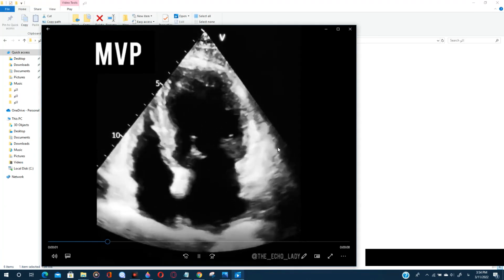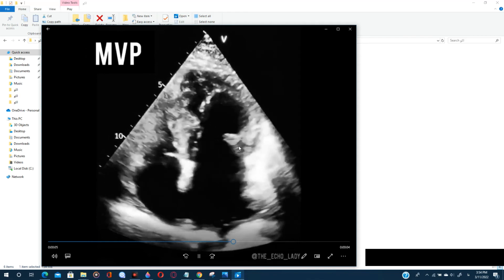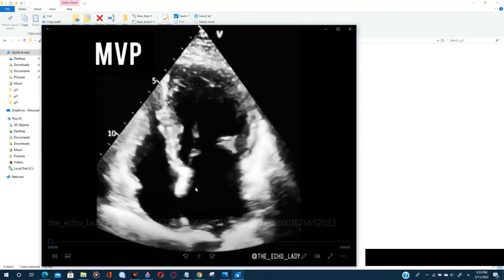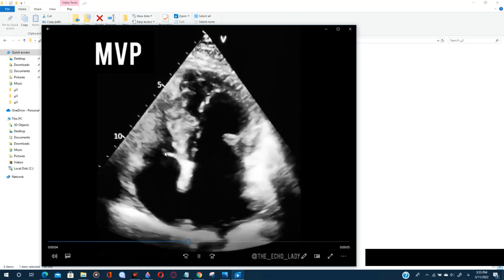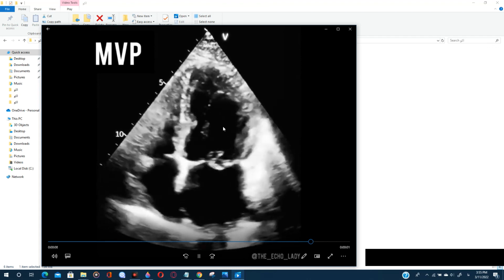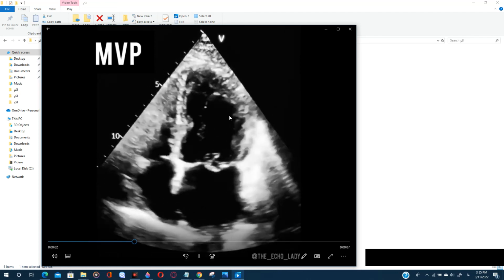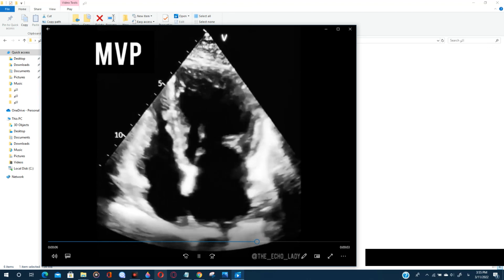To find the EF, or cardiac output or ejection fraction, we have two ways. One way is visual in echocardiography. The cardiologist sees the contraction. If we have normal contraction, we say normal LV function.